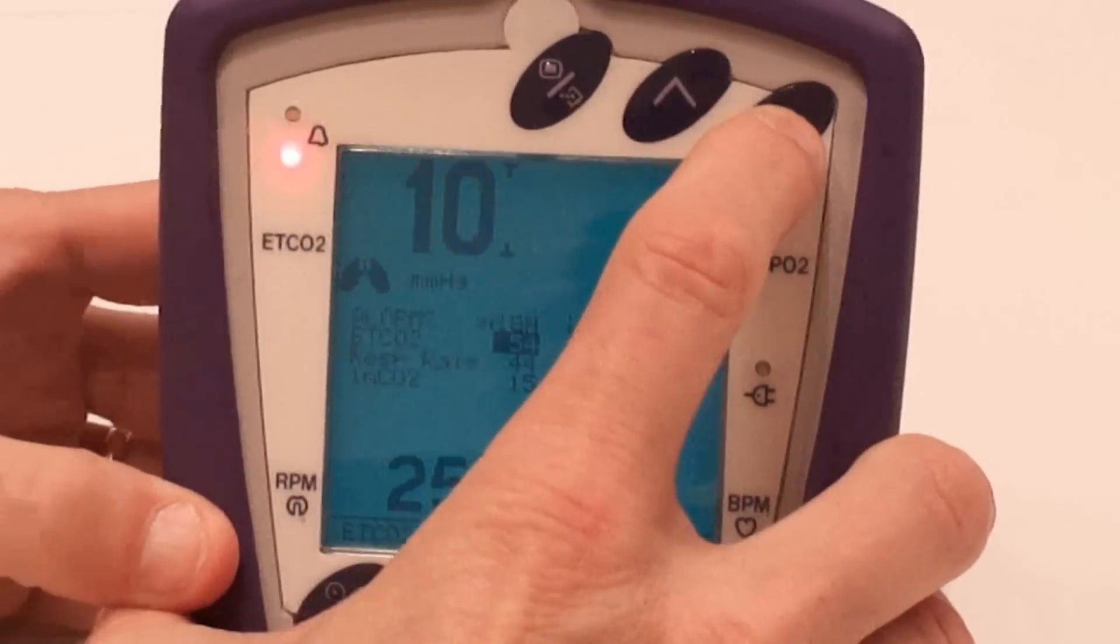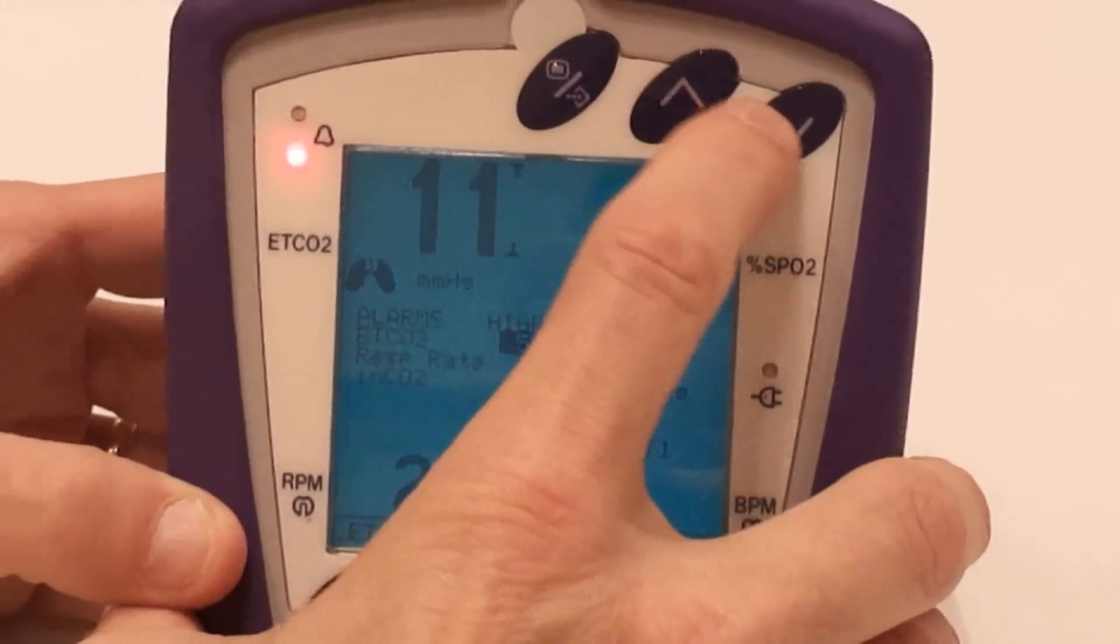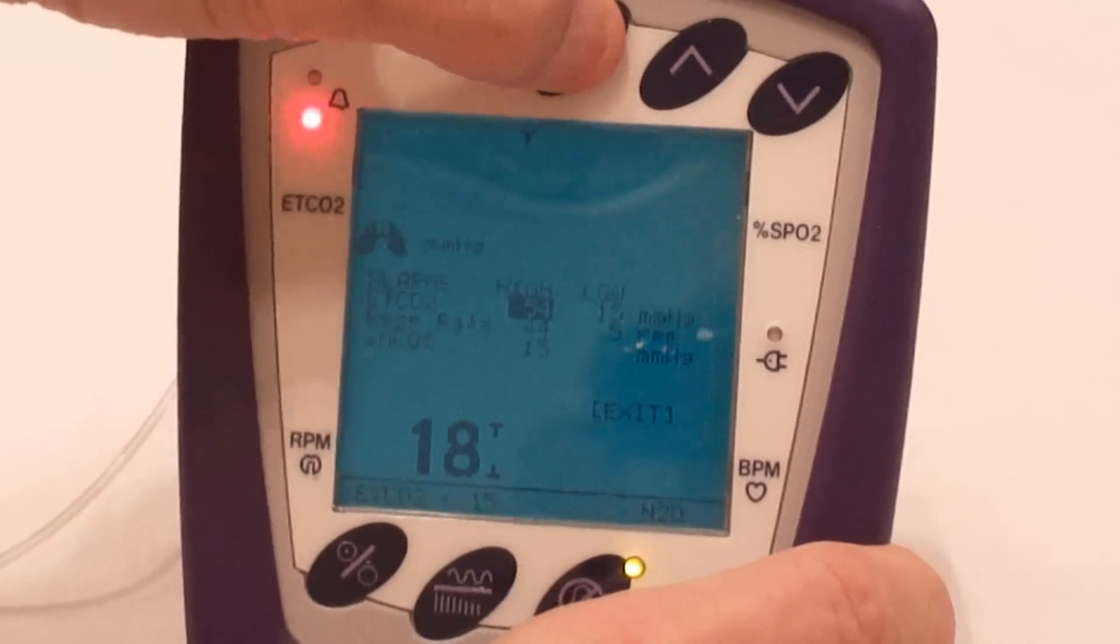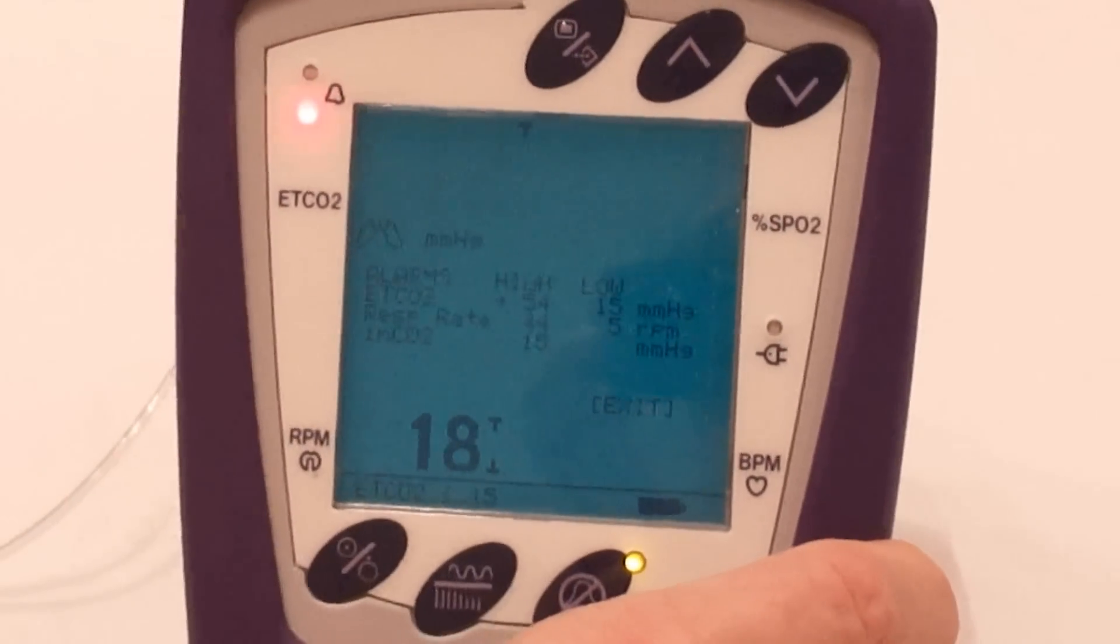Then we can make it go up or down. In this case, we're going to take it down to 54. Then we press the menu button and that locks it in at 54.